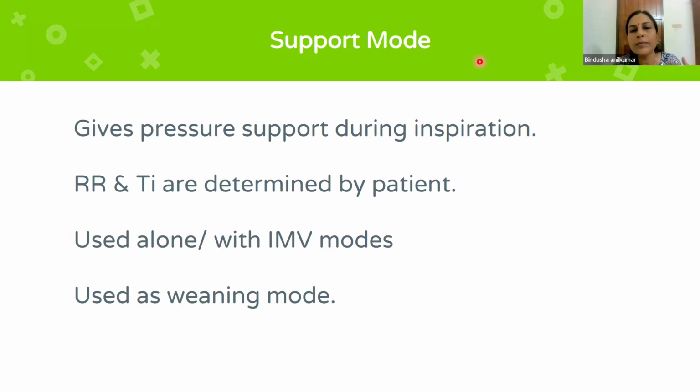Okay, so it can be used alone, or it may even be used in between the SIMV. It can be used as a weaning mode also, but it is not used as the initial mode in pediatrics. When you are putting the patient under a ventilator, it's better that you go for pressure control ventilation, and pressure support ventilation will be used only during the weaning.